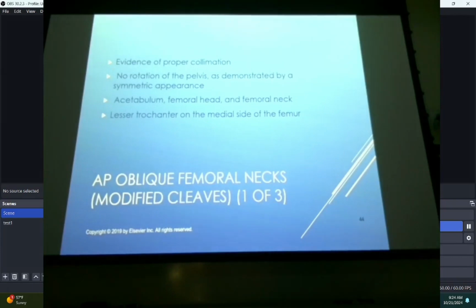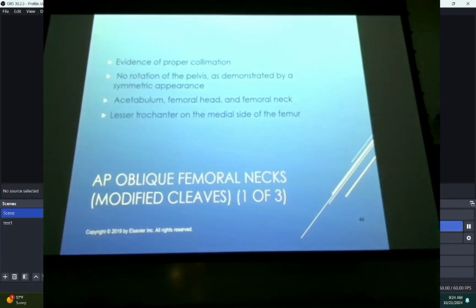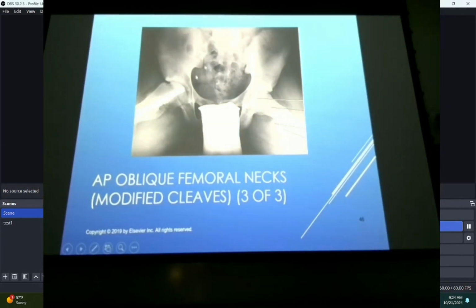And you should get what you're looking at on the opposite page, 8.23. 8.23 is this image right here. And that is kind of your stereotypical appearance of a hip nail. Okay. So we'll describe that here in a minute. And I think I told you the process of this one before.